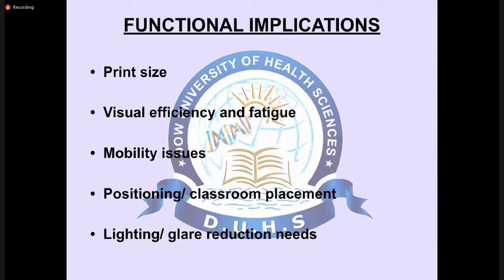When we examine the visual acuity, we place the patient at the designated distance, usually 20 feet or 6 meters, from a very well illuminated Snellen chart. So, this will make more sense when you come to the department and you actually perform visual acuity on a patient in front of a well illuminated Snellen chart. Then you will understand, because this is a sort of examination that you have to do.